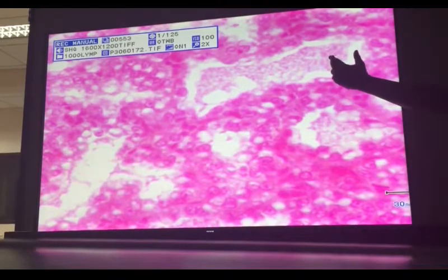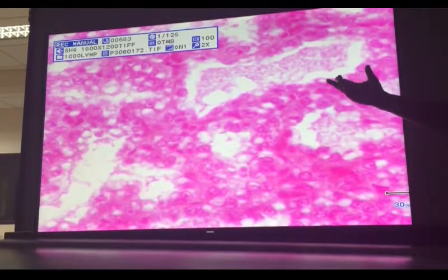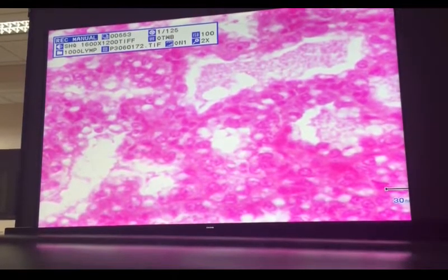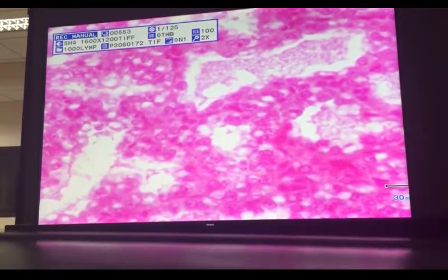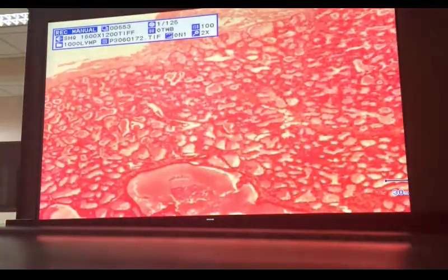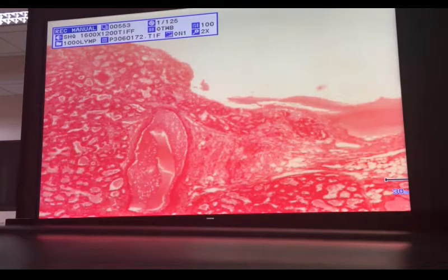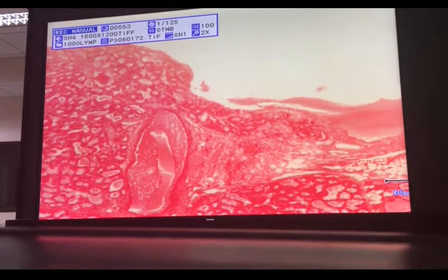Now, what is the color of the milk that you can see? Pink. Maybe strawberry flavor. That is the appearance of a lactating mammary gland. That is the appearance of an active lobule of acini.